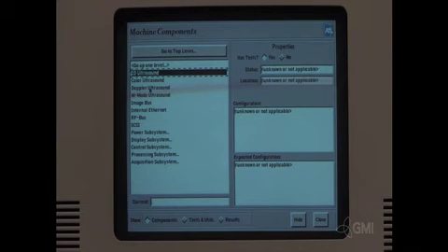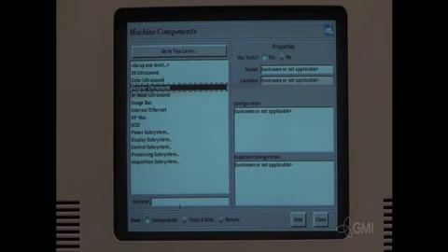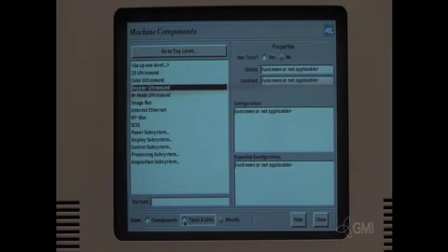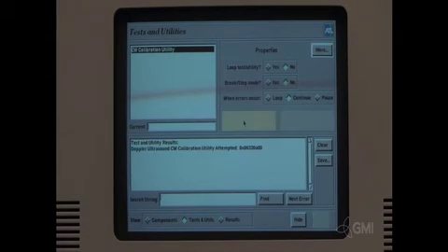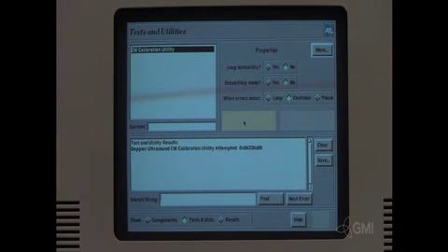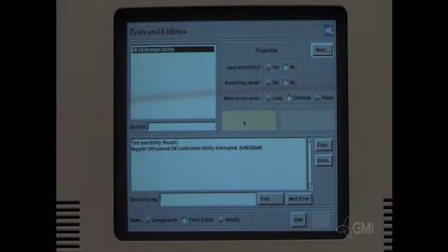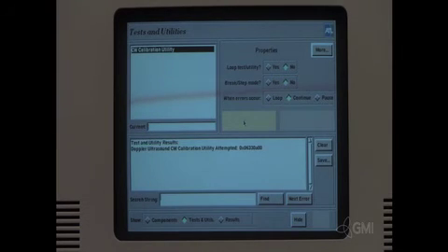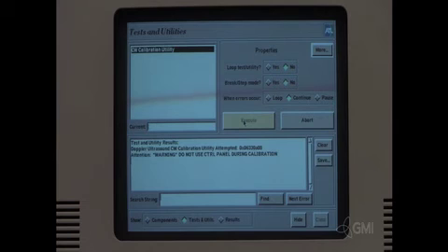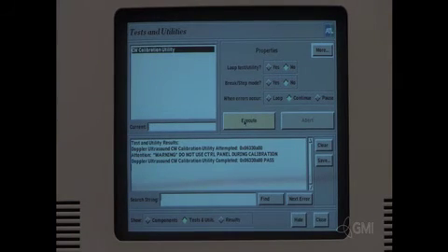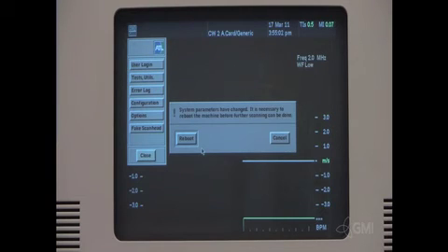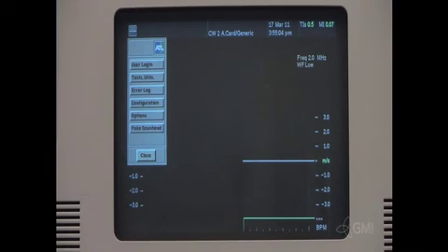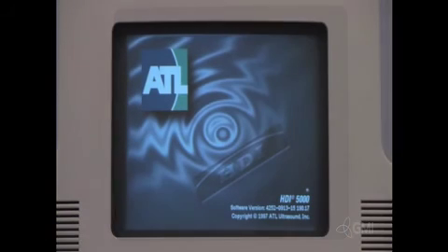Select Doppler ultrasound. Select test and utilities. Select execute. Once the calibration is complete, select close. Select close. Select reboot. The system will eject the backup disk during the reboot cycle.